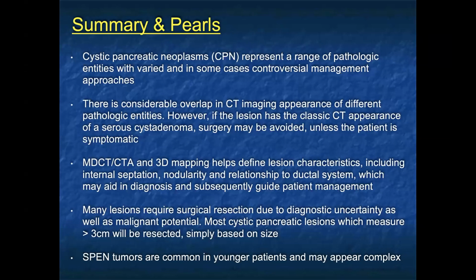Okay, a question about how do you differentiate cystic mets from multiple abscesses on CT? Usually with abscesses on CT, besides perfusion changes around the lesion, often you have septations, often there's wall thickening, and also the patient is typically febrile. When you have liver lesions and they're abscesses, the patients are not afebrile. Typically with mets, the patients are afebrile. Also, you have a good history.